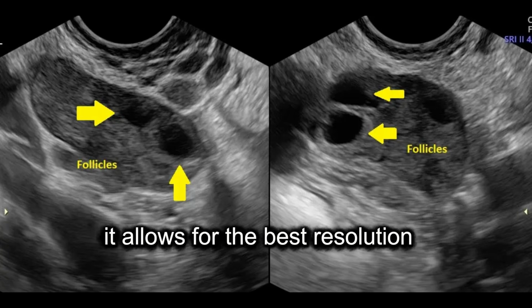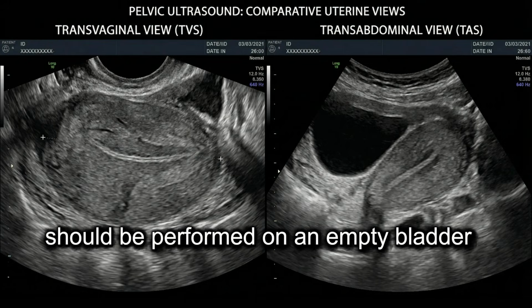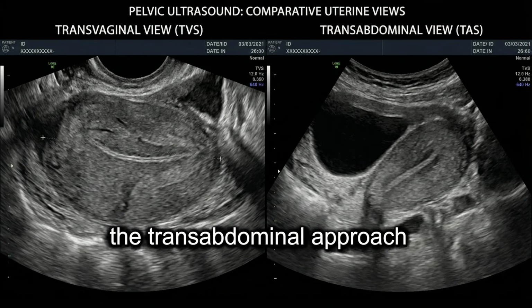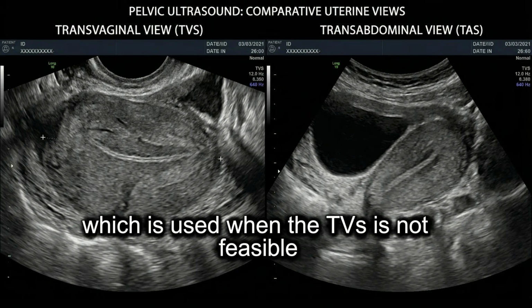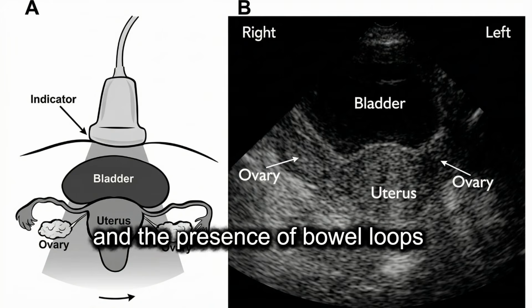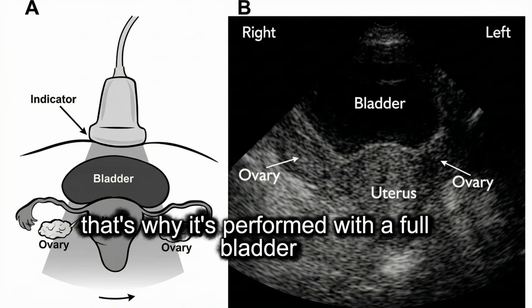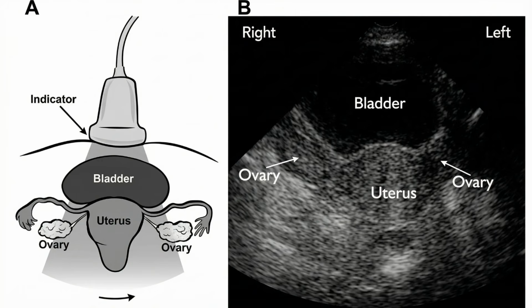The most optimal approach to assess the ovaries is transvaginal ultrasound. It allows for the best resolution. The transvaginal ultrasound should be performed on an empty bladder. The transabdominal approach, which is used when the TVS is not feasible, is limited due to lower resolution and the presence of bowel loops, which often shadow the ovaries. That's why it's performed with a full bladder for optimal visualization.